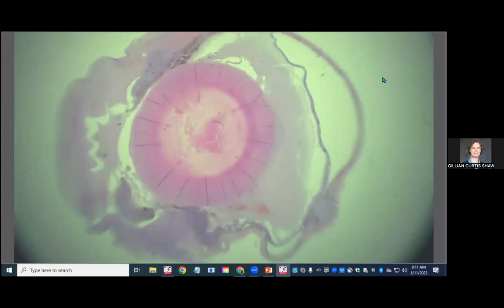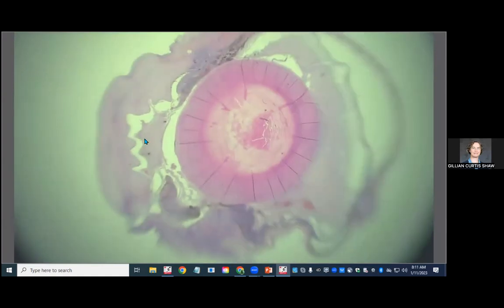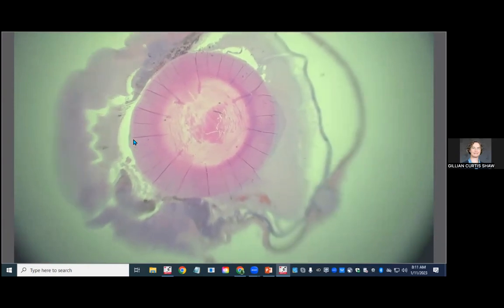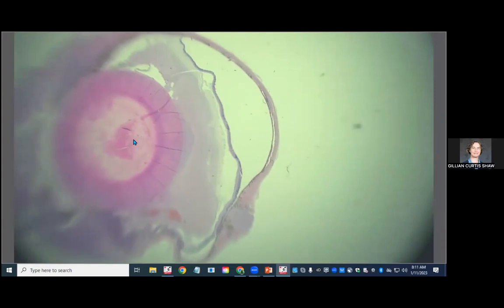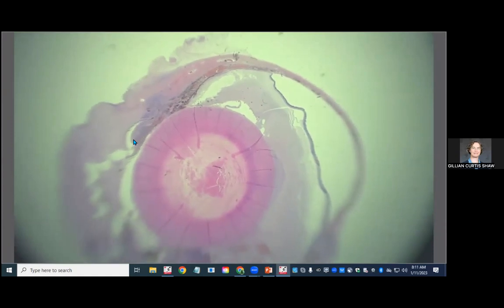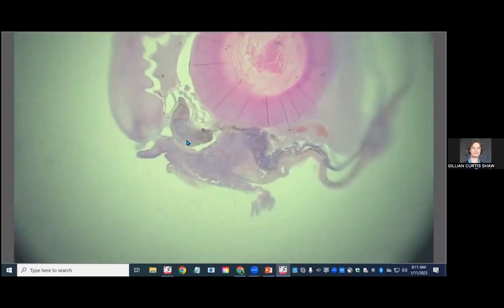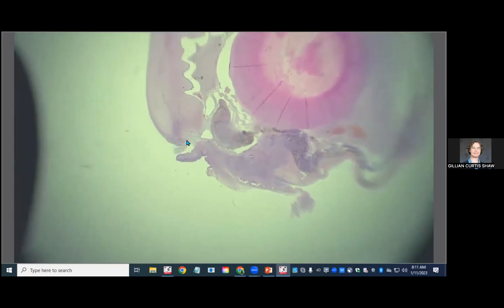So cornea is on the left. I'm going to put the mouse in the middle because that's always more helpful. Cornea is on the left. We can see that the globe is filled with purple and pink as opposed to clear space like we want it to be. This is iris here, which is far more cellular than we want it to be. And then here is the limbal nodule that we described. And as you can see, it is not so much a nodule as a big hole.